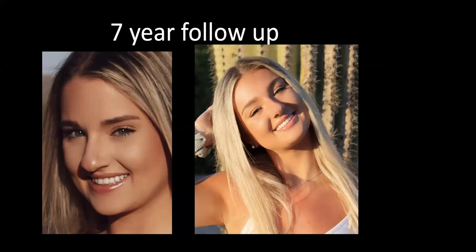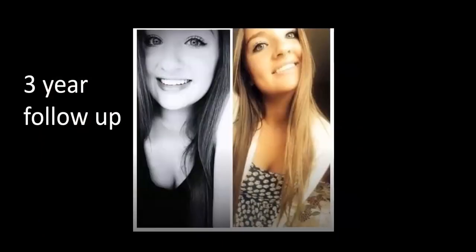If you were to put porcelain veneers on these teeth at age 13, what's that going to do to the opposing teeth over the next 90 years? Porcelain is at least 7 times harder than enamel. It's going to wear out the lowers. And what happens when her gums move? The soft tissue, these teeth are still erupting. If you have a margin, it's going to show. With the Bioclear method, there are no margins. Let me back up and take a look here.